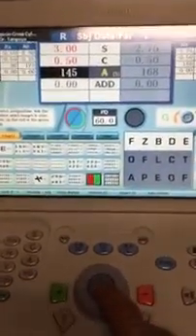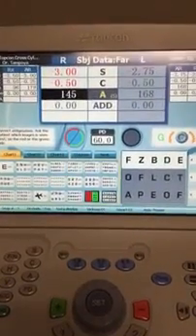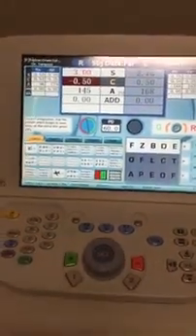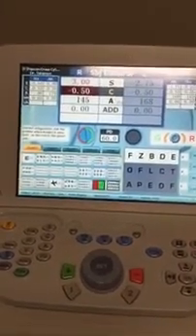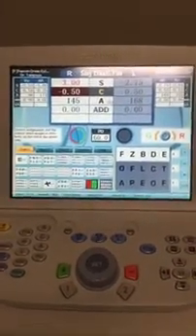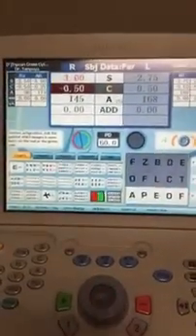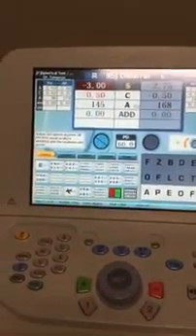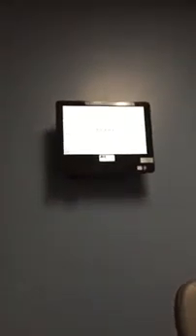Okay, so I'm going to press the set button. I'm all done with the axis. Okay, you will see that it moves up to the cylinder, and I say which side is more clear, the right side, the red side, the left side, the green side, and they say it's about the same. Great, so I'm going to press the set button again, and it moves on to the sphere. When it moves onto the sphere, it'll automatically go down to the 20/25 line. And you can see here, it is at the 20/25 line, corresponding to the 20/25 line, APEOF.